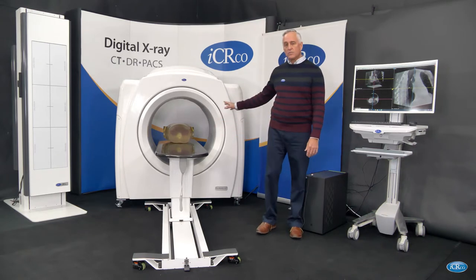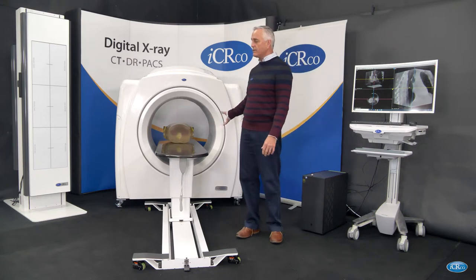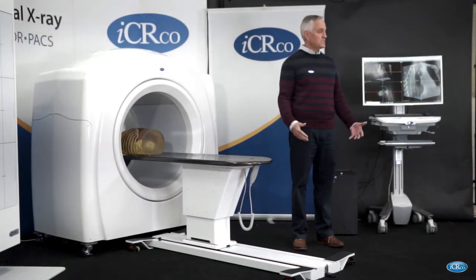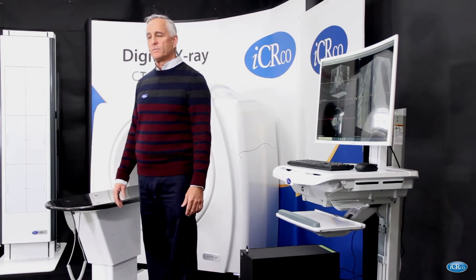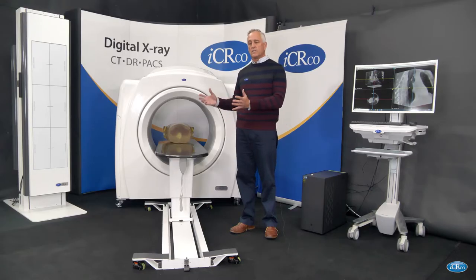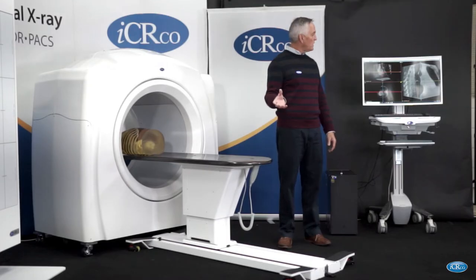The exam takes 22 seconds. Every single image is captured — 360 images around the patient. They're all high resolution chest images, chest x-rays, and therefore we can use those also to aid in the diagnosis of the patient. So we have 360 chest images from this study as well as a reconstruction which gives us a 3D view of the patient.